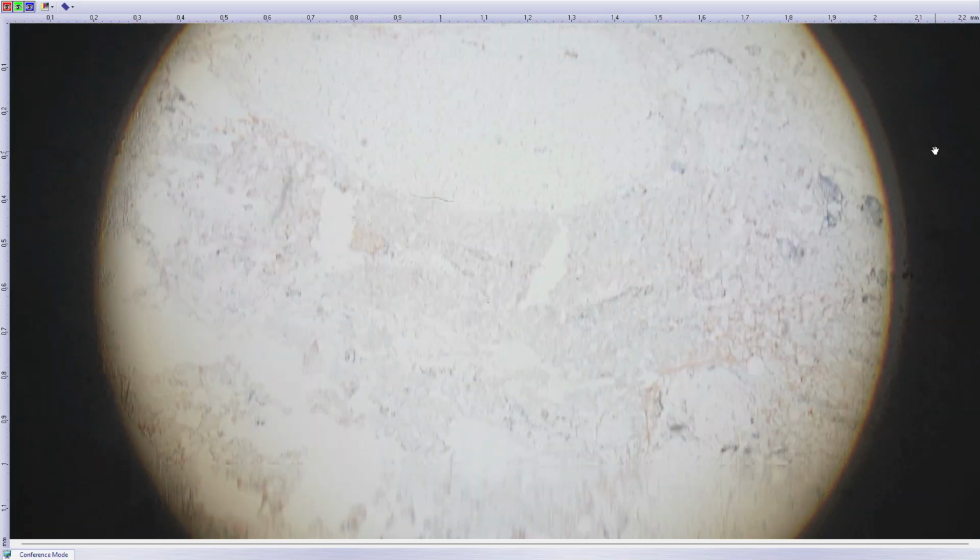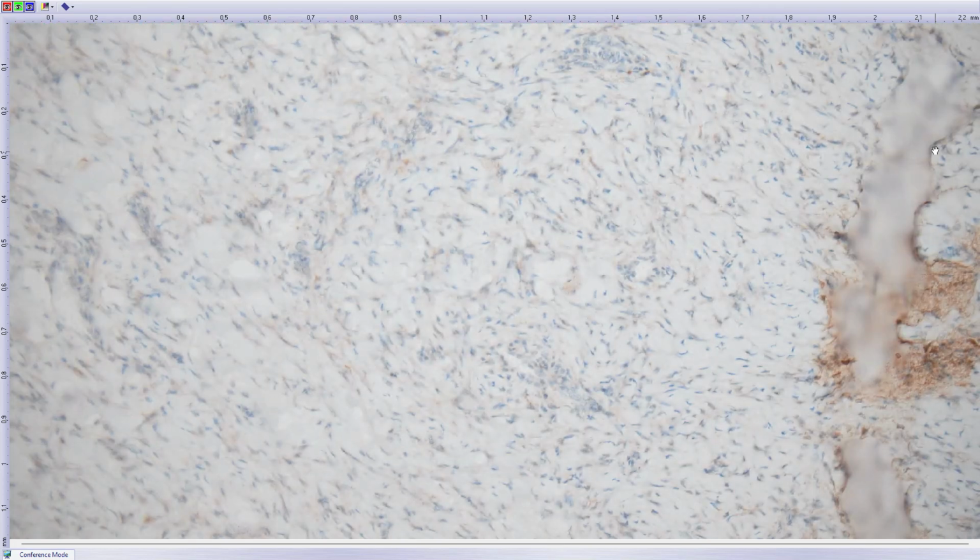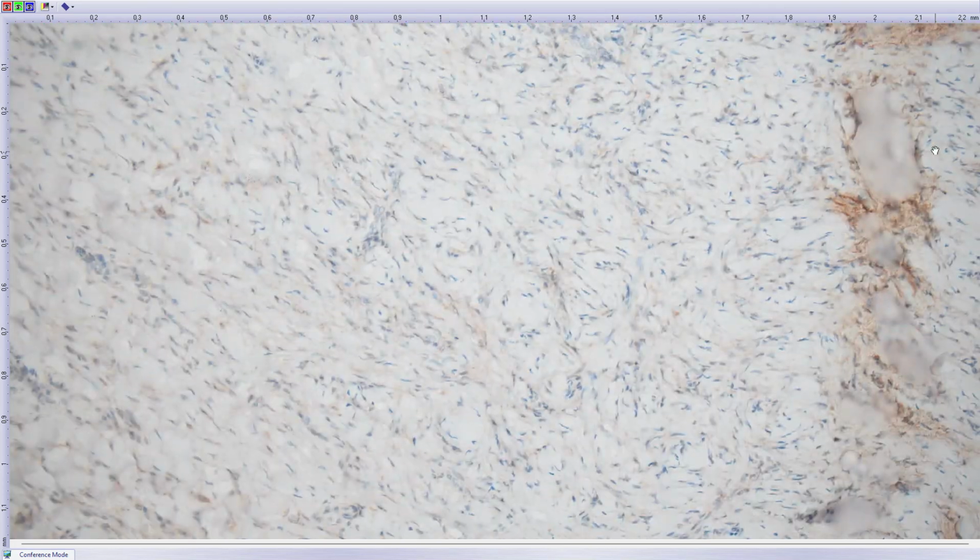Then another perineurial marker is claudin 1. Which you can see there's some faint color. It looks like it's maybe staining, but I'm not sure. The immuno is sometimes hard to read, and this is so weak. But you can consider it positive or negative based on the overall impression, basically.